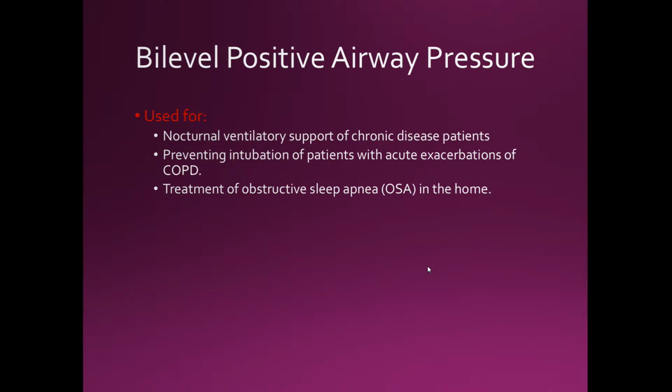It's a ventilator mode that affects ventilation. If you have an oxygenation issue, you will use CPAP. Obstructive sleep apnea is an oxygenation issue.